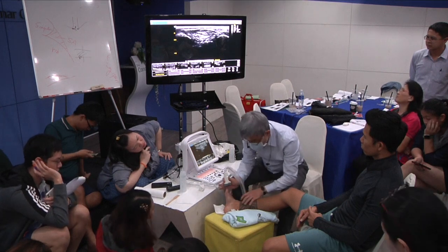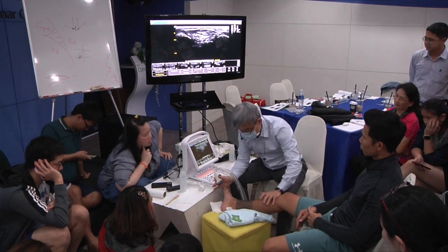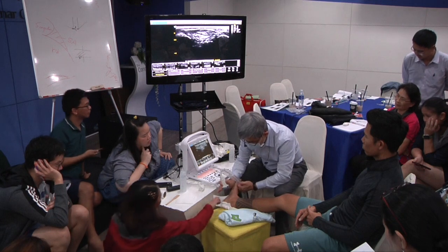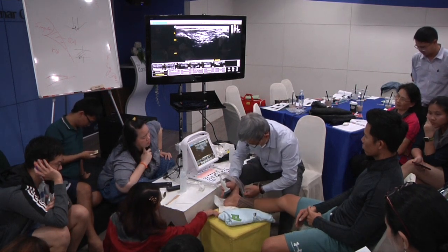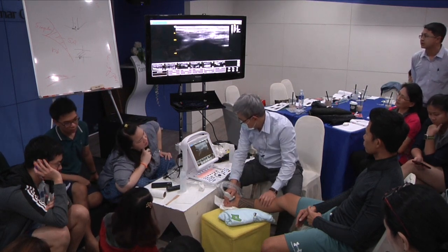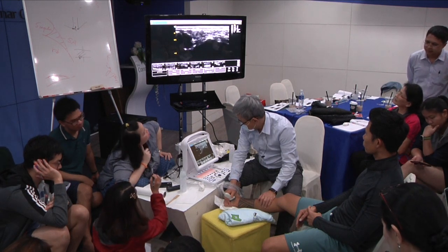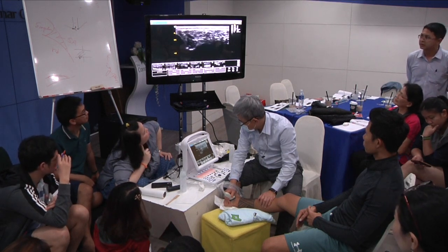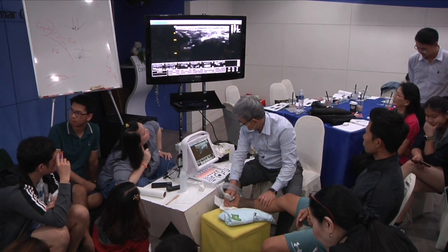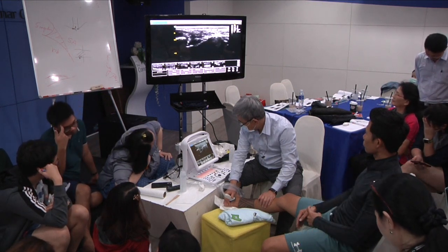Okay, so in his case, straighten your knee, yeah. Dorsiflexion. Yeah, change the alignment. Yeah, thank you very much. It's become very easy. Okay, freeze.